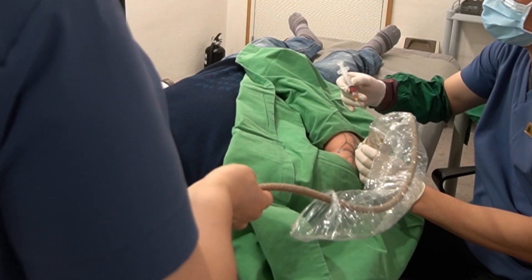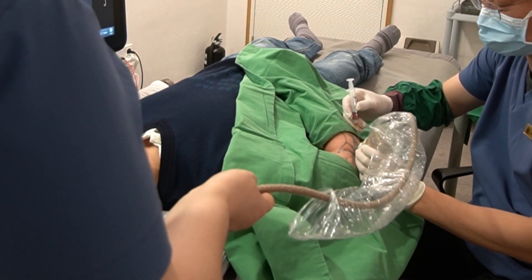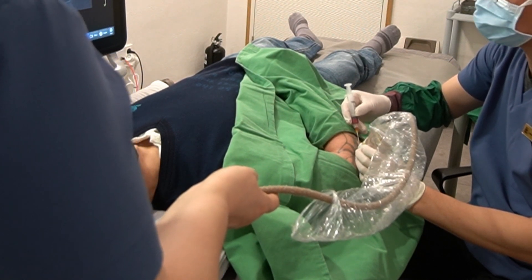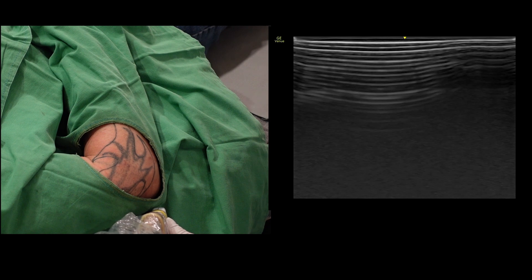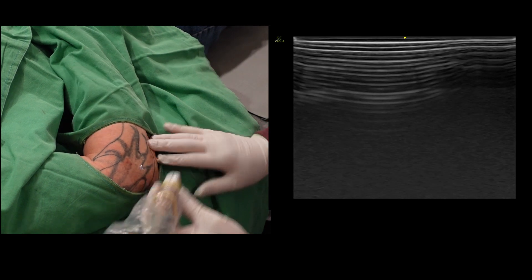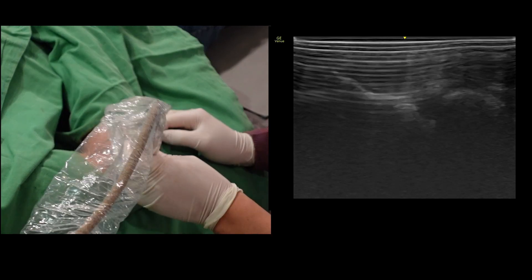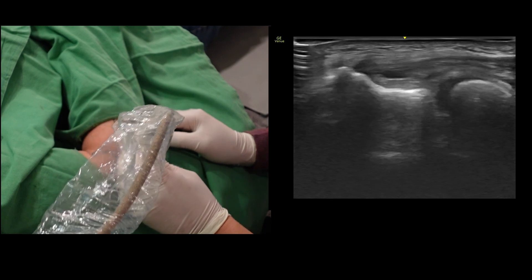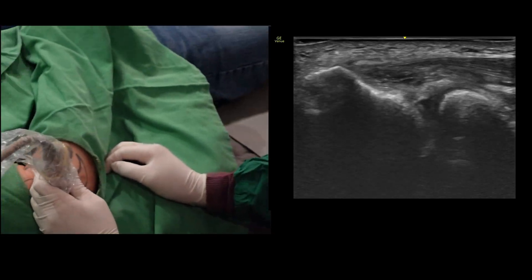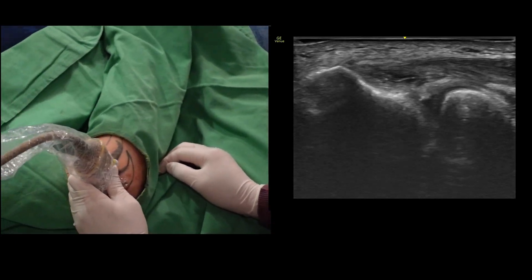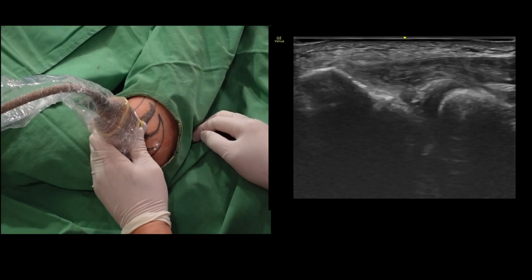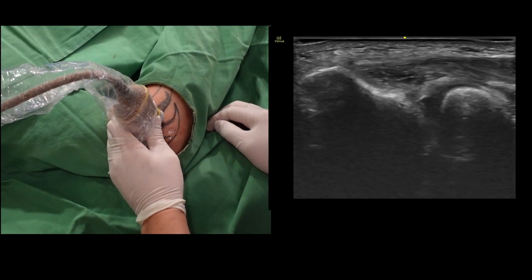Let me help you understand the meaning of low echo texture and linear echogenic lines in the context of tendon pathology. Here in the operating room, I will demonstrate the enlarging defect in the torn area of the extensor carpi radialis brevis tendon. I'll show you the ultrasound features of this tendon once again.